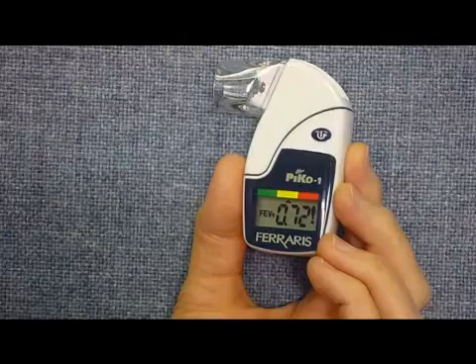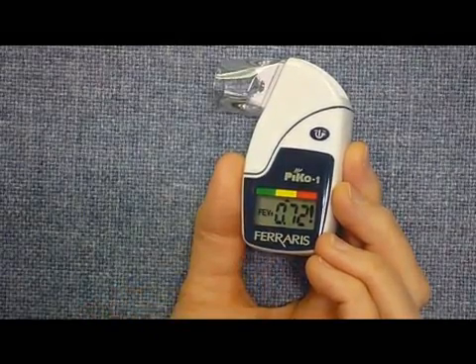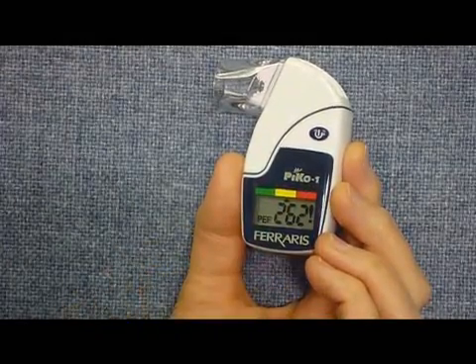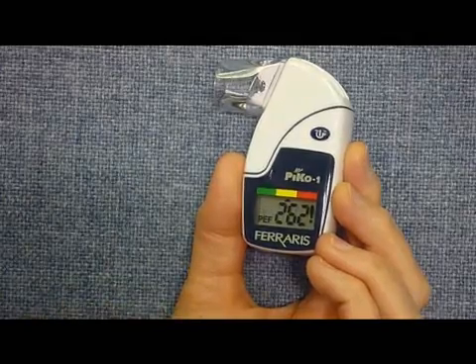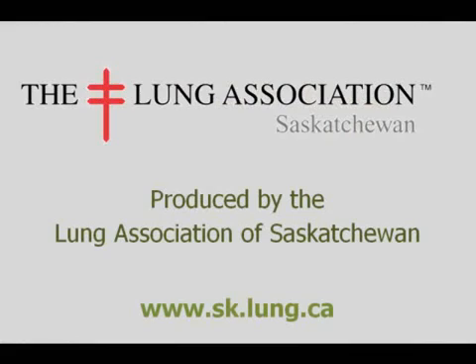So when recording this PICO-1 FEV1, we want to be sure we're recording valid numbers. Anytime you see an exclamation mark behind your number, do not record that one. There has been an error in doing the test, and you don't want to record that one.